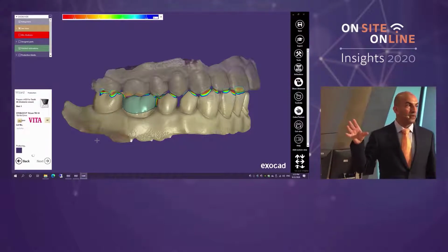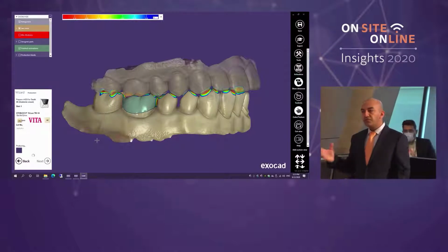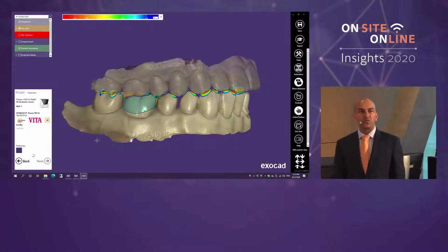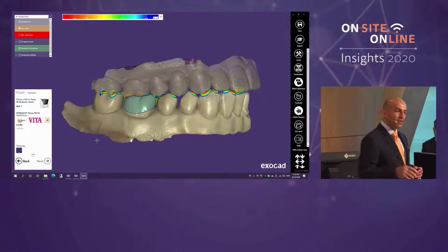That's a molar, okay? It's relatively quick, and I'm talking as I'm going along. Obviously, you need some time for preparation of the tooth as well, and that depends on what tooth you're preparing and what the patient is, but right now we're working relatively quickly.